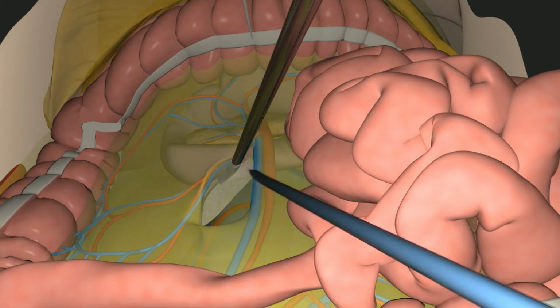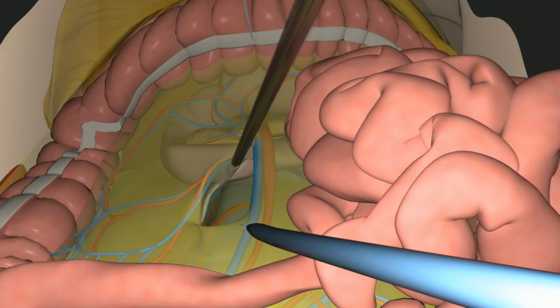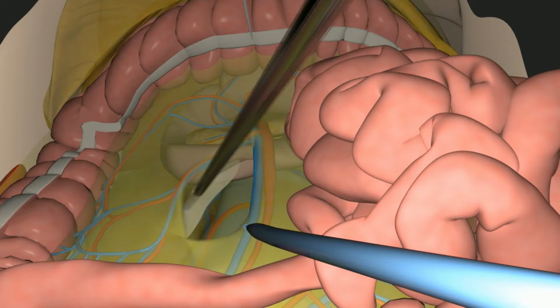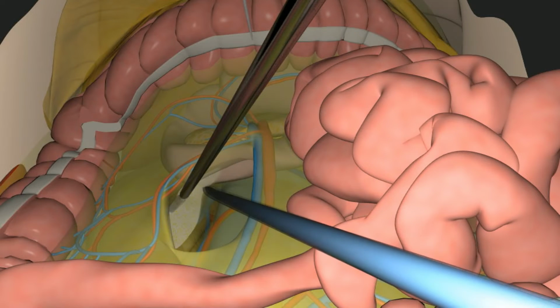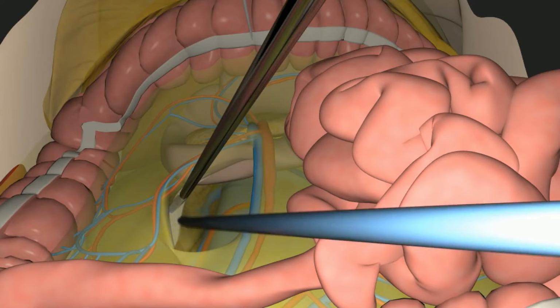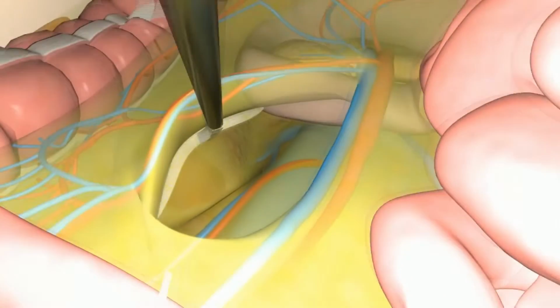Within this embryological plane, we encounter retroperitoneal loose tissue and the duodenum, which is separated from the mesocolic fascia by sharp dissection. The dissection plane is created by traction and countertraction. The areolar tissue is created by this manipulation. The parietal plane and the mesocolon must be well preserved.